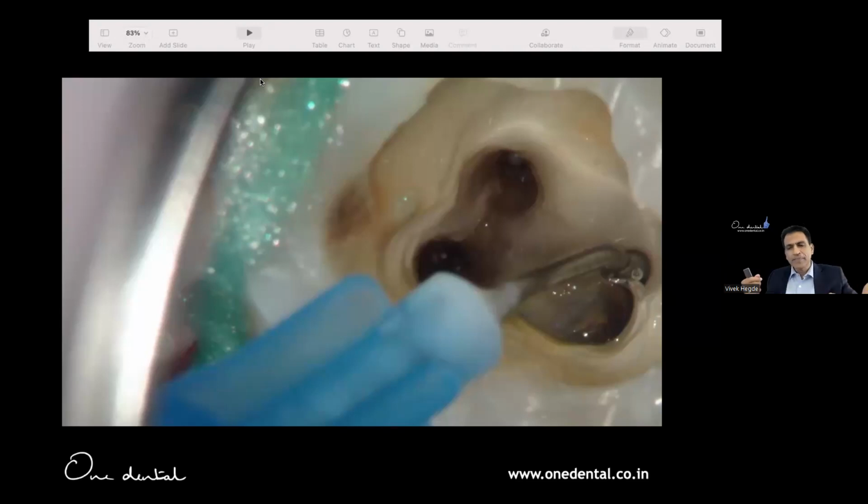Do it manually. Otherwise, in endodontics, there's nothing you lock. You lock only two things. One is for intrapulpal or intracanal anesthesia. And the second thing is for microaspiration, manual. When you deposit irrigation, you don't inject, you eject. And the needle is always passive, please, not active. If you do active and deposit, it's going out. We don't want that, right? So that's where it is.